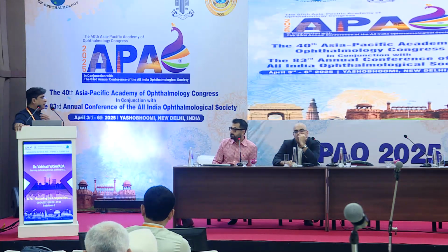Torics are definitely a good option above 7 years, if you can mark up. I do use torics above 7 years of age, but I've never used multifocal because I don't know what it does to the contrast. There have been good articles saying you can use multifocals after 5 years of age, but I have never used multifocal before 15 years of age.